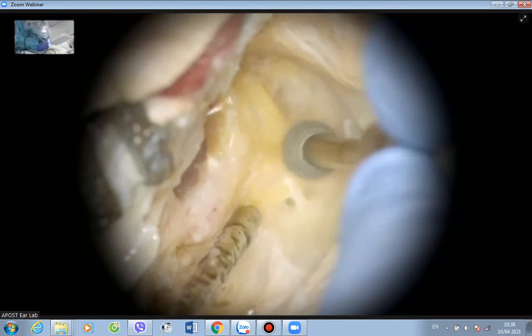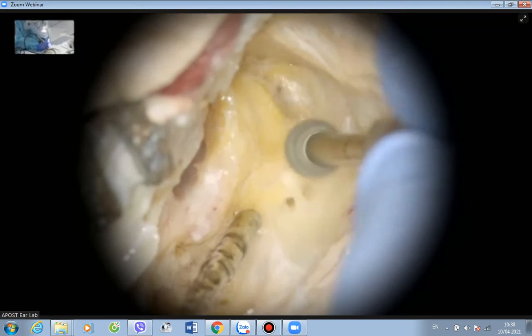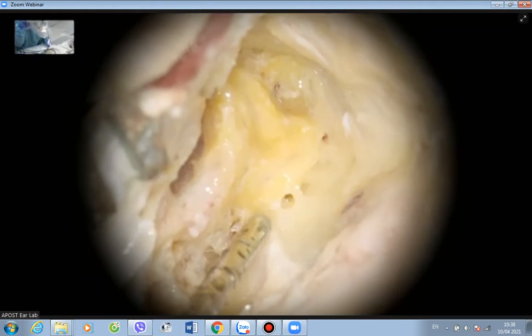Say, 我要個4mm 嘅 cut diamond。Okay, I'll zoom in a little bit to show you.